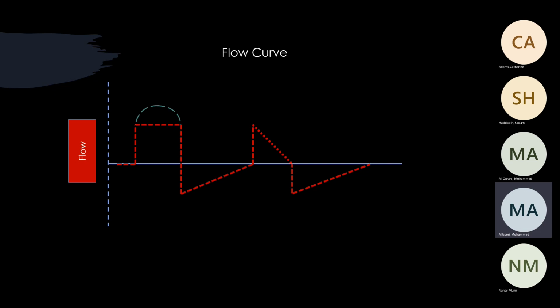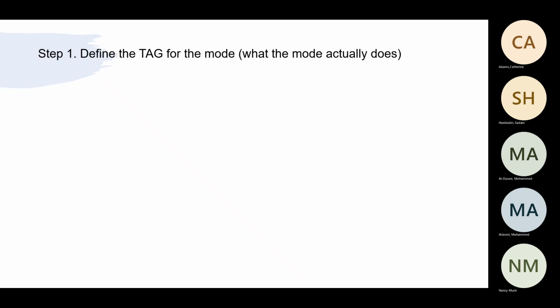And in a COPD patient, if you do decelerating, that will sometimes take a longer inspiratory time. That's why sometimes in the COPD patient, we can do a constant square flow, which will give you a shorter time for inspiration and more time for expiration. However, you can control the timing during inspiration in both of them. So that's about the flow.